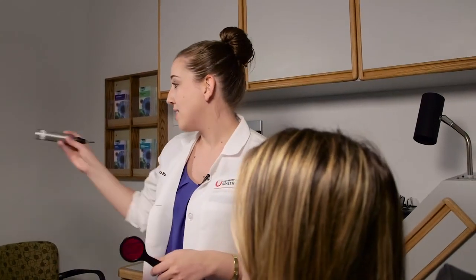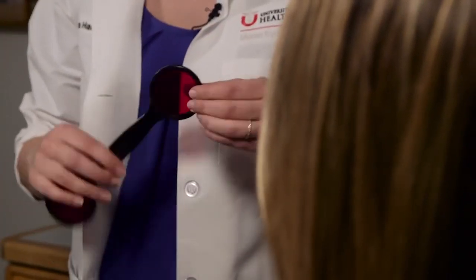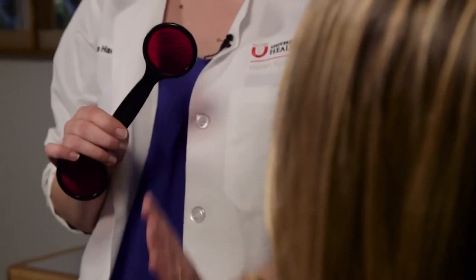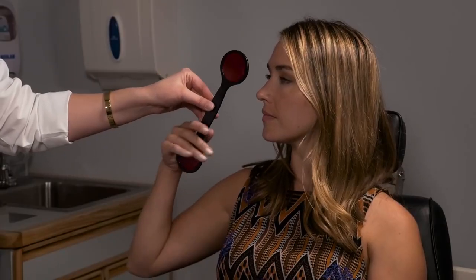For the next test, we're going to do the Maddox rod. I have an assistant here. The Maddox rod is a series of cylinders, and you can have the patient orient them vertically, which will give you a horizontal red line, or you can have them oriented horizontally, which gives a vertical red line. The idea is that you give the eyes two very dissimilar images, and so you can very precisely measure the deviation.